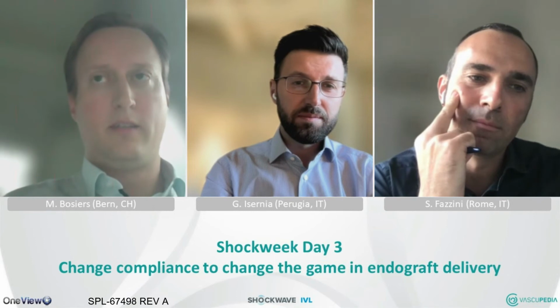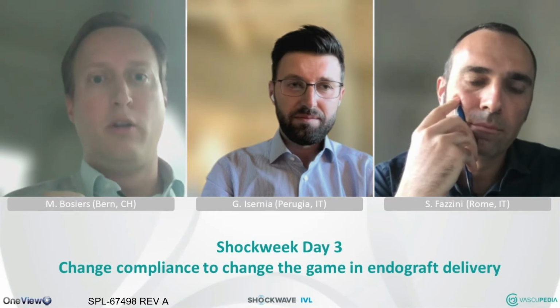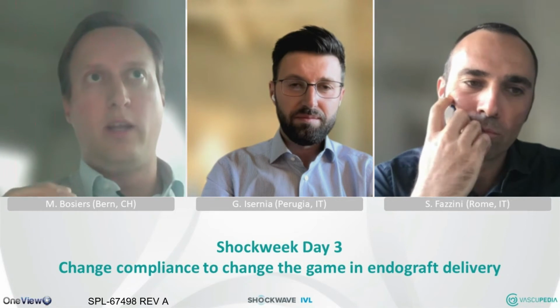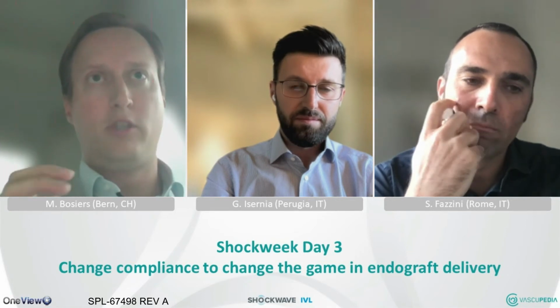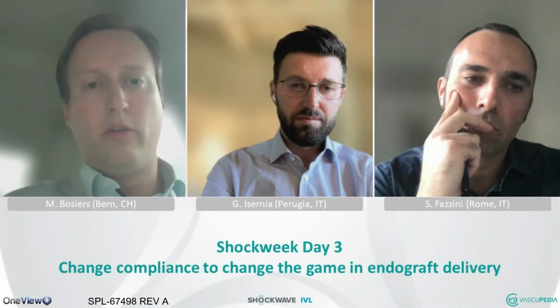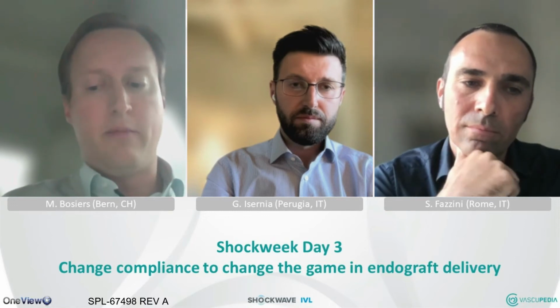I think this is a very important topic because you're using low pressure. You don't look at it as a balloon per se. You look at it as a low pressure device to really obtain luminal gain, to change the vessel compliance, to remodel your calcium burden at the level of your iliac axis. I think this is very important. For me, I agree with both of you.